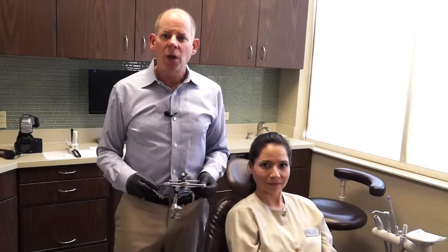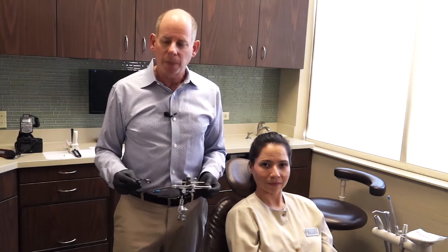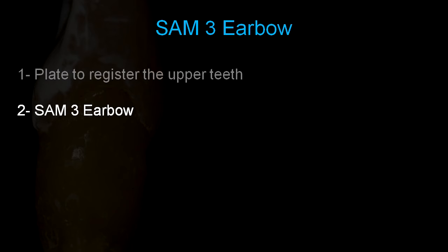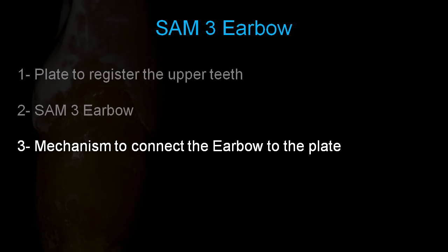Let's get going — I'm going to show you how we work through our ear bow system. The system I'll be using today is a SAM 3 face bow, and I'll show you why I like using the SAM 3 system. With the SAM 3 and most ear bows there are two or three parts. The first part is the plate you use to register the upper teeth, then there's the actual ear bow itself, and then the mechanism that connects the ear bow to the plate used for registering the patient's upper occlusal arch.